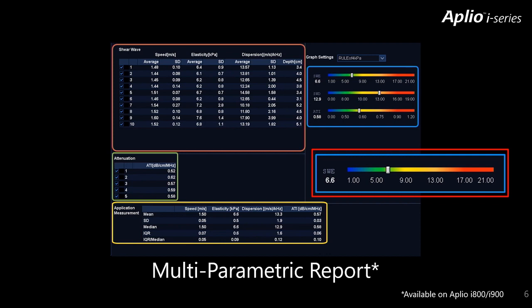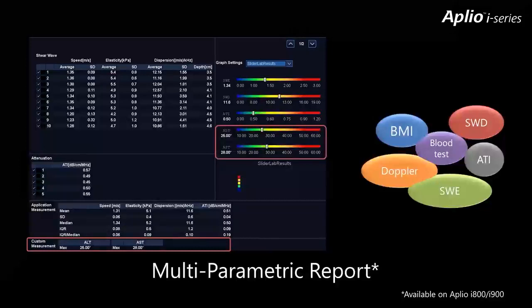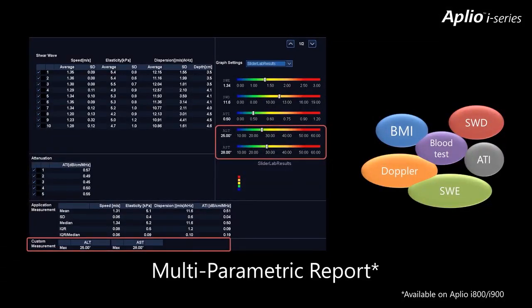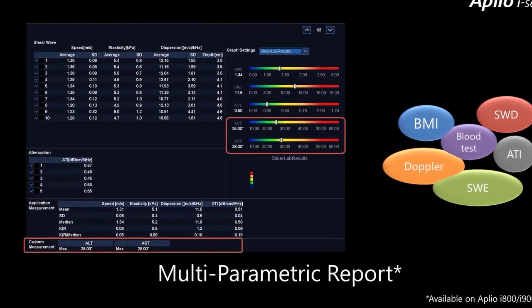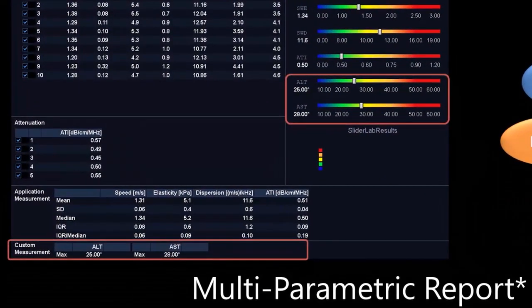With the multi-parametric report, you can quickly see where the current patient's shear wave results lie in terms of the Rule of Four on a scale of 5, 9, 13, and 17 kPa. The multi-parametric report can also be customized to incorporate clinical information such as BMI or lab values for a more comprehensive assessment of the patient's liver health. Here, we've added AST and ALT lab values to the multi-parametric report, and those can be displayed alongside your quantitative imaging findings for shear wave, shear wave dispersion, and attenuation imaging.